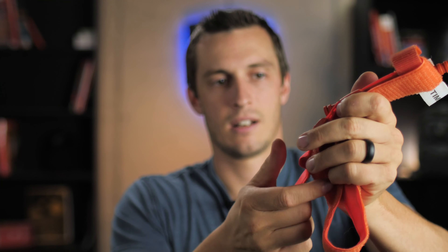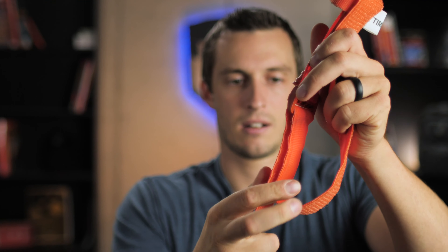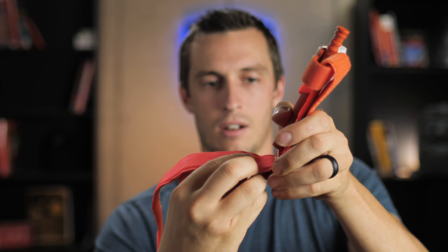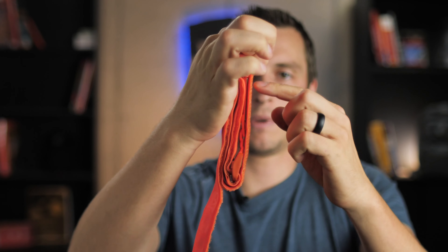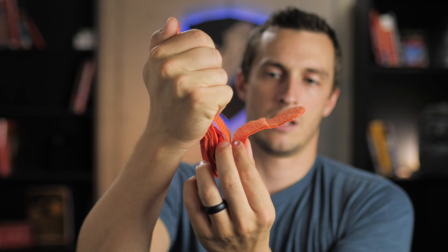Go ahead and flatten this back out, take the tail and stick it to the tourniquet. Now fold this tail up under there and it fits nicely right up under this plastic clip. Push this back down — the only part that's going to end up on the back is one strap and then whatever tail is left over that goes back up.